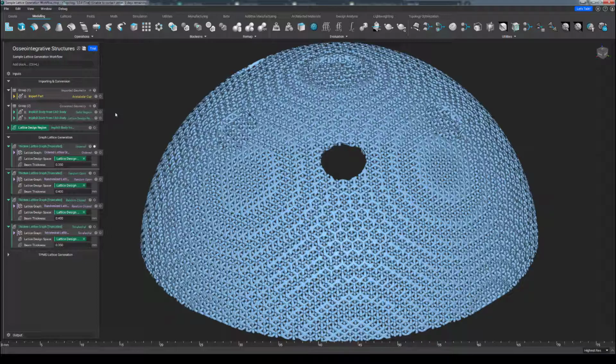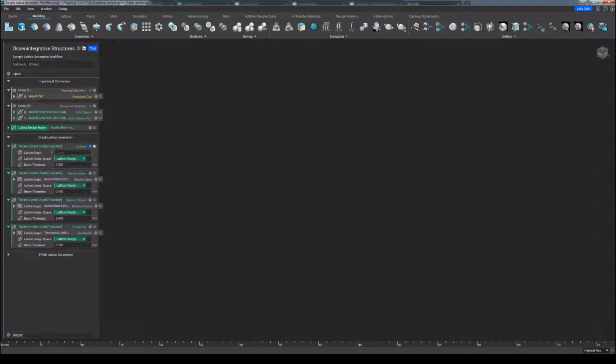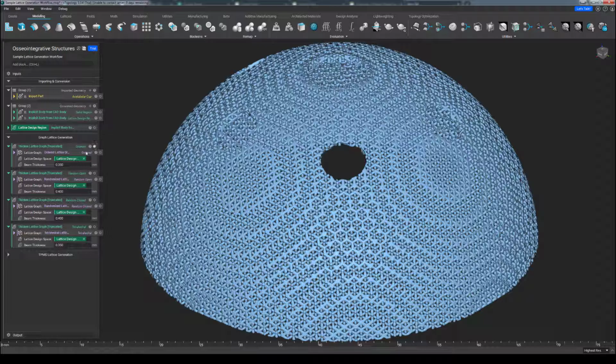As you become more familiar with the software, you may find yourself wishing to create your own unique variation of structure. For example, you can always start from scratch to develop your own workflow that outputs a graph lattice, and that can then be dropped into our thickened lattice graph custom block. Or you can use the existing custom block that we provided, such as this ordered lattice graph, and use that as the starting point to make your own modifications. Whichever methodology you do choose, the idea is to offer a sense of modularity when designing these workflows. As time goes on, the user may themselves replace some of these custom blocks with those of their own, and that in itself is a really great sign you are learning how to use nTopology better and better.